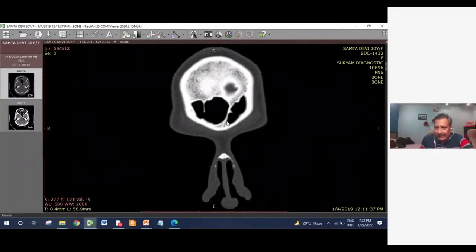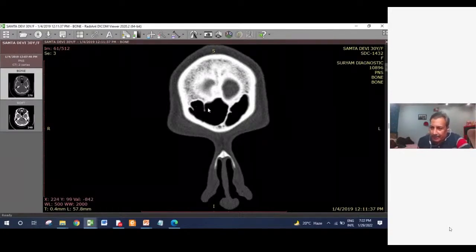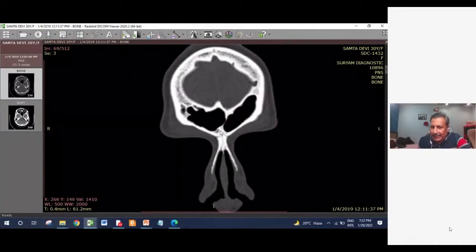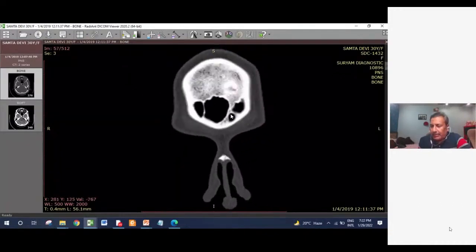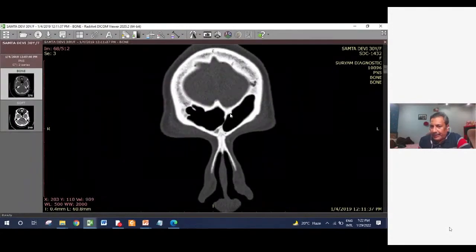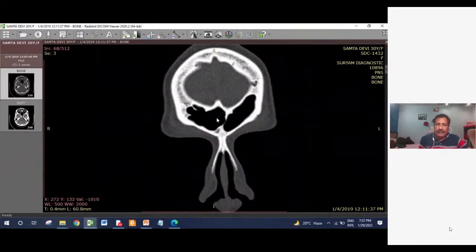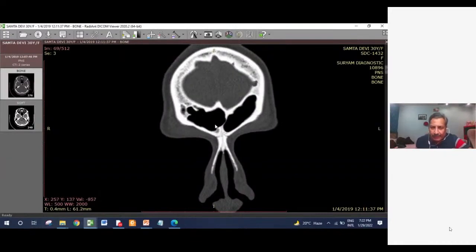This is the intersinus septum. Why am I calling this the intersinus septum and not the others? Because those are incomplete septations and scallopings you can see. The true intersinus septum is going to go all along, right from the beginning till posteriorly. See the intersinus septum dividing the frontal sinus into two unequal cavities. The intersinus septum is never in the midline. It is almost always unequal.